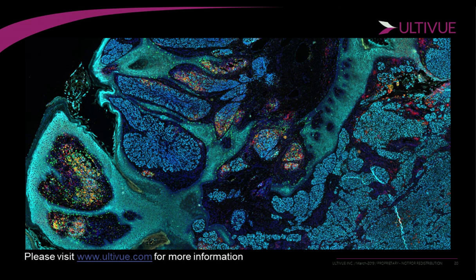I've also had slides that I've carried around with myself for 6 months in my bag, and they still scan incredibly well. That's also to keep in mind. It also is a little bit dependent on what type of scanner you use to visualize these. Our dyes are very stable. They're very robust, so we don't run into a lot of photobleaching. But if you're using an older type scanner that is dumping full amounts of white light directly onto the slide while scanning, you do run the risk of starting to photobleach, which obviously would impact the stability and the longevity of those dyes for long-time storage.